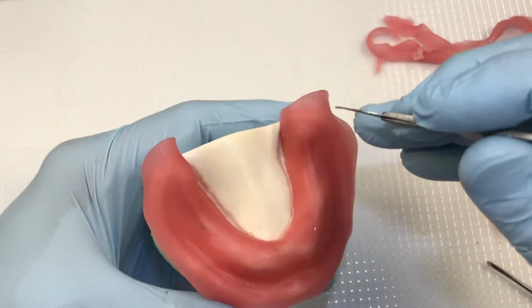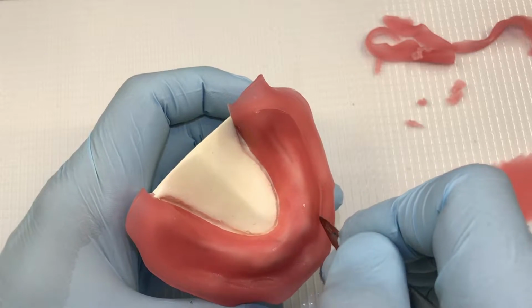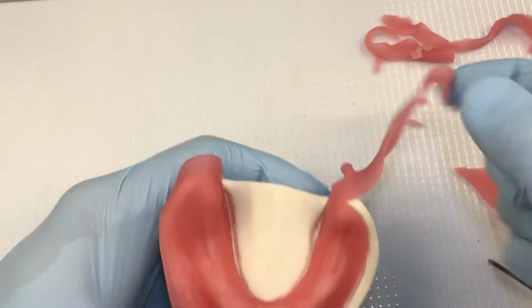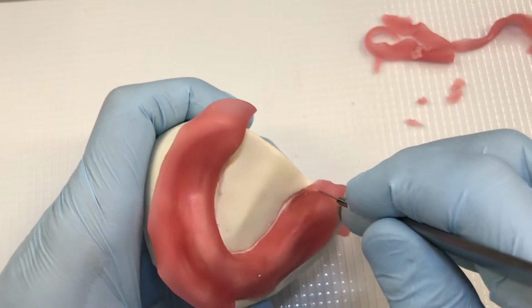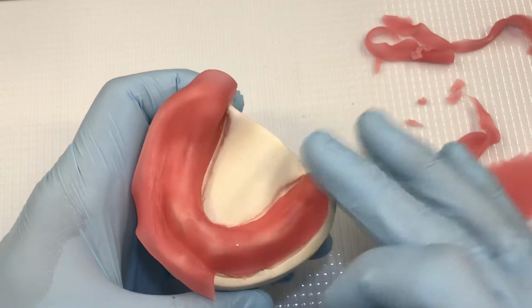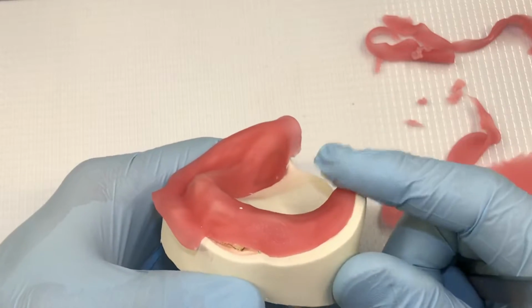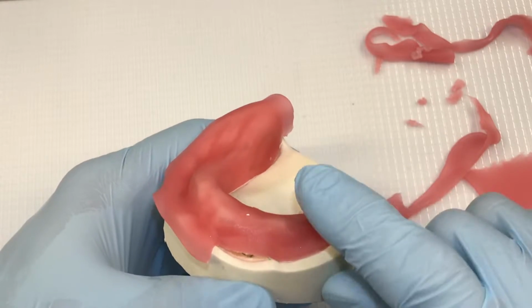So right back here, I'm going to continue over the retromolar pad. I'll stop here and see how far I get with this. Notice that over the retromolar pad, I go right to the edge. I don't leave room for wax there because if you do, the little bit of wax that you're going to put back there, I think it's just going to peel off. So make it a habit of just going right to the edge back here, but tapering it towards the model. You can see that I'm putting pressure here and tapering it, give it a nice smooth finish towards the model.